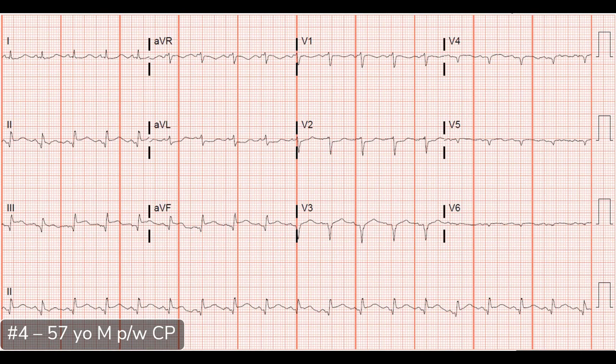For the most likely culprit artery, I'd put my money on an RCA lesion. The reason being it has inferior involvement, we start to see the high lateral depressions, and given the associated depressions in V1 and V2, this is highly consistent with an RCA occlusion.